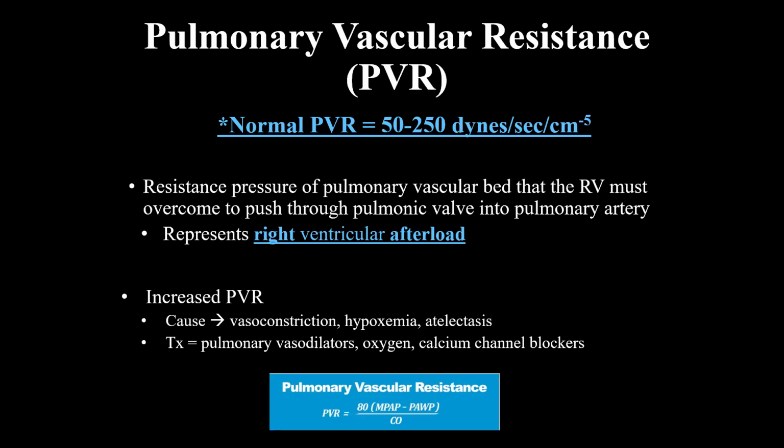These are calculated. Let me say this one more time. A calculated value, I hit a button. Deb Phillips knows the formula. Please do not memorize this formula here. Okay, I hit a button and it gives me the PVR.